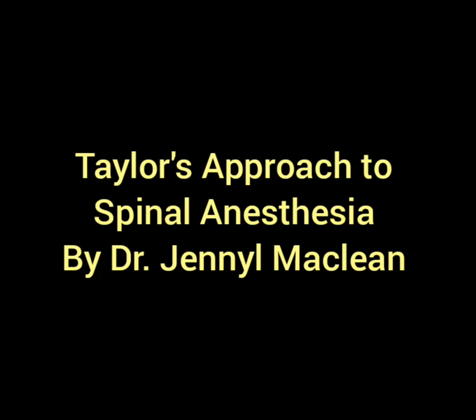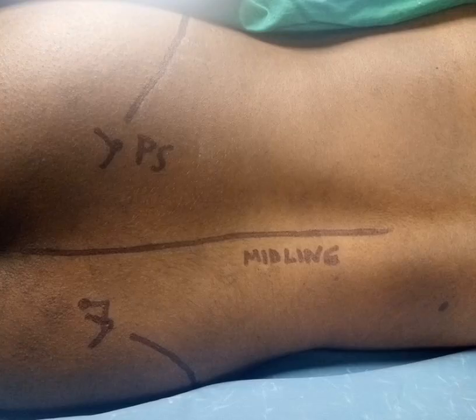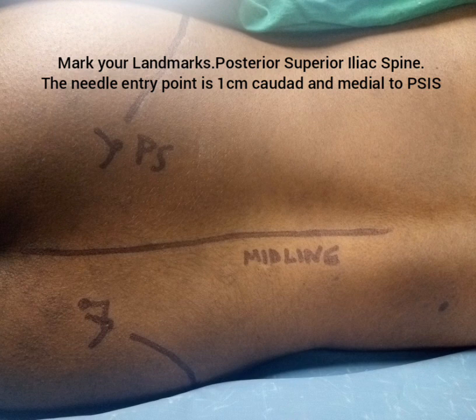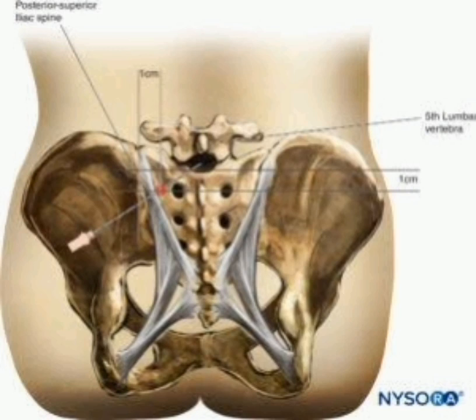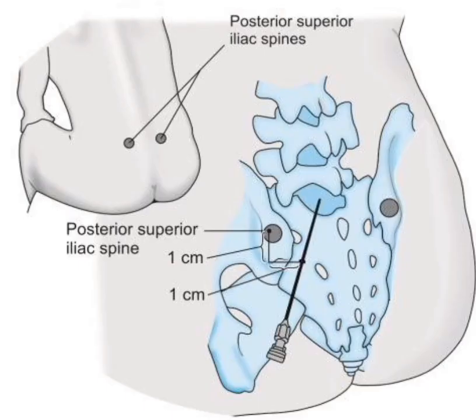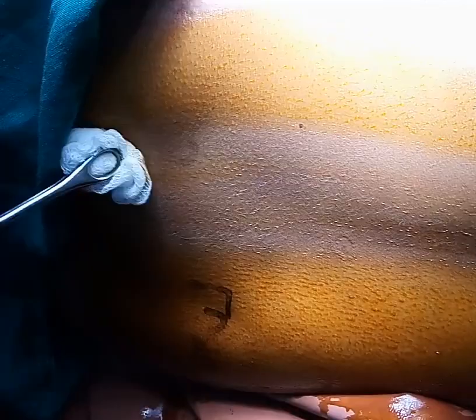Hello friends, today we will see about Taylor's approach of spinal anesthesia. With the patient in lateral position, mark your landmarks. The posterior superior iliac spine — the needle entry point is one centimeter caudal and medial to it, to enter into the L5-S1 intrathecal space. As you see here, the patient is in lateral position, the body parts are being painted and draped.